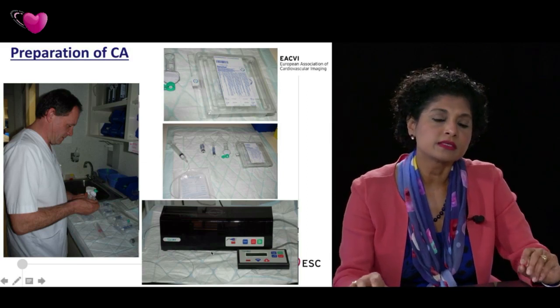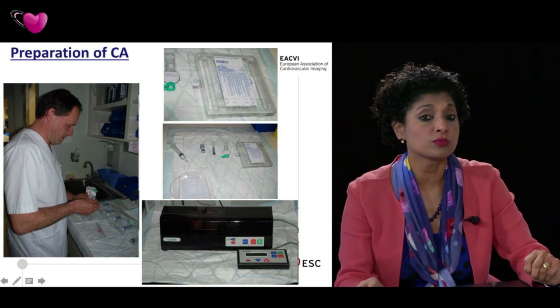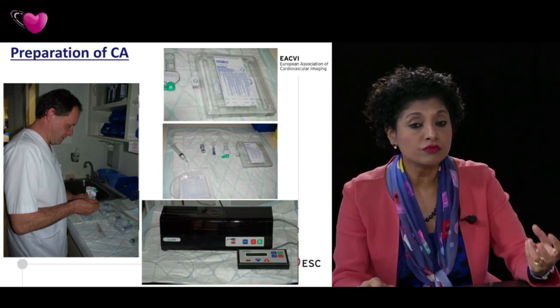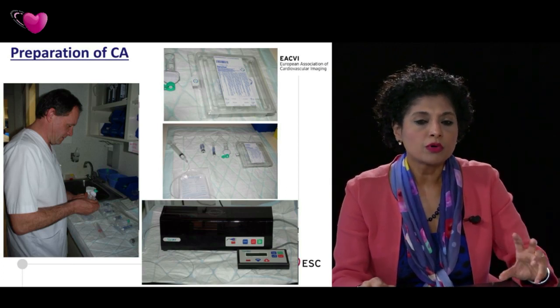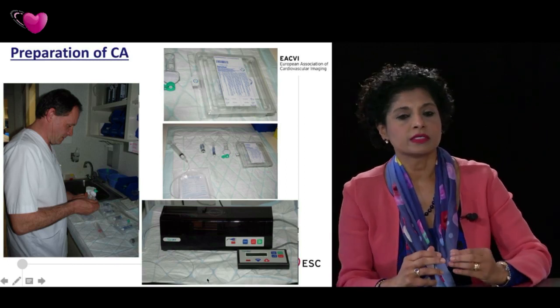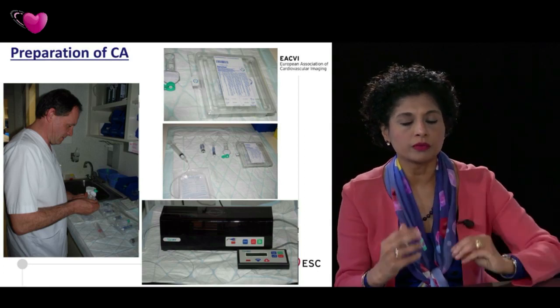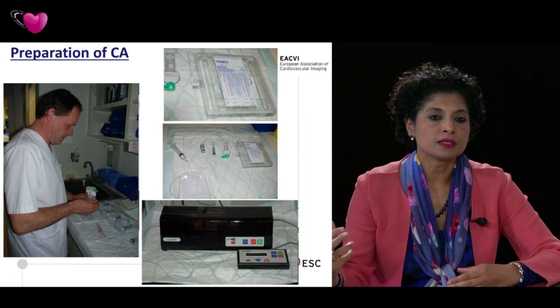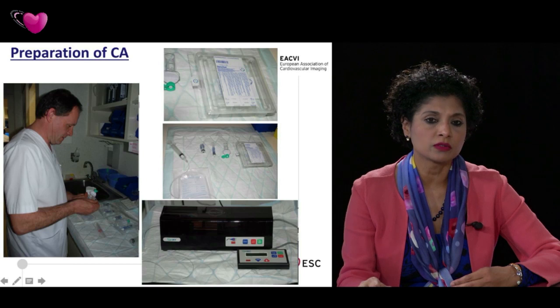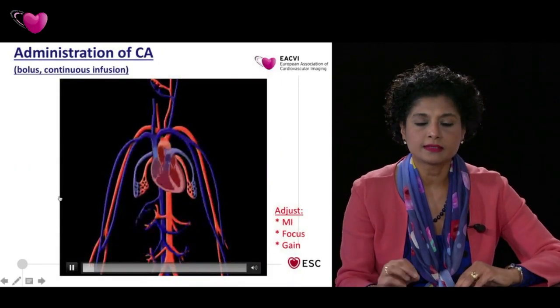Either you can inject it as a bolus, or you can give a continuous infusion, for which the special pump developed by Bracco is used, and it actually mixes and infuses at the same time. Now, important to realize is that optimal contrast concentration is required for optimal images, so you have to really talk to the person. You have to work together very well with the person who's actually administering the contrast. This is an important issue, and you must understand that aspect very well.